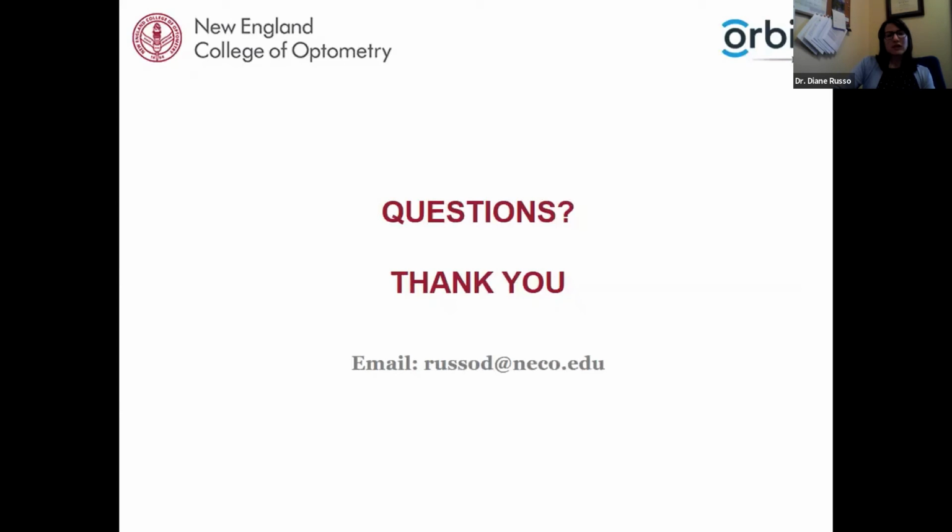If a patient has other complaints like dry eye or allergic conjunctivitis, would you rather treat, and for how long, and then give the patient another appointment for the refraction? So I think preferably, part of it depends on how severe the condition is, and do I think that it's impacting their vision to the point where it will prevent a reliable refraction.